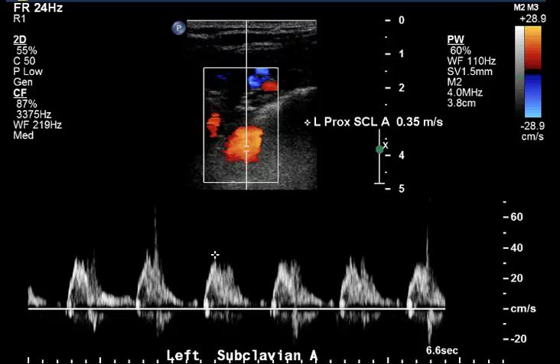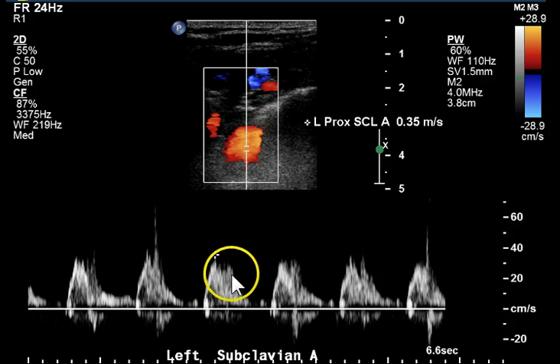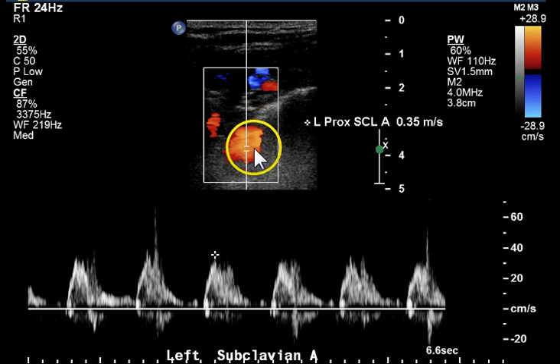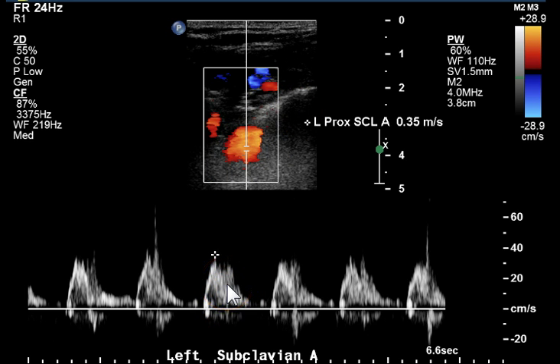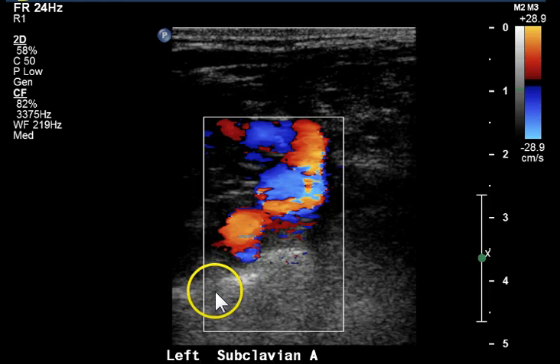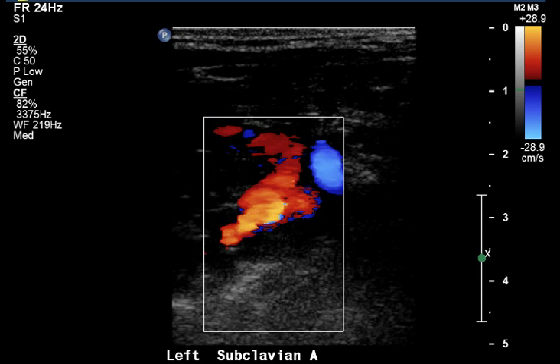The proximal subclavian artery on the left is highly disorganized. This is a rather difficult to interpret image because we can't discern flow direction, but clearly it's not a triphasic waveform. It doesn't have a sharp upstroke and appears to be disorganized. This is a color image of the proximal subclavian artery.